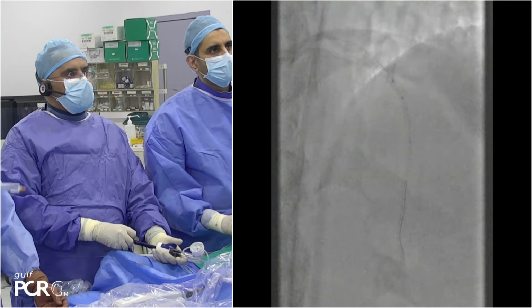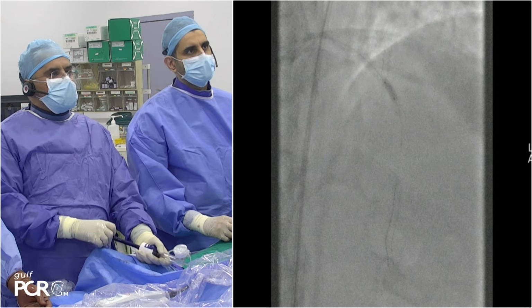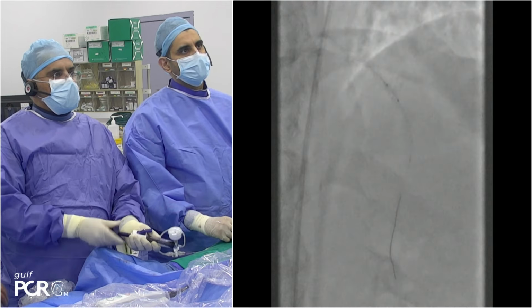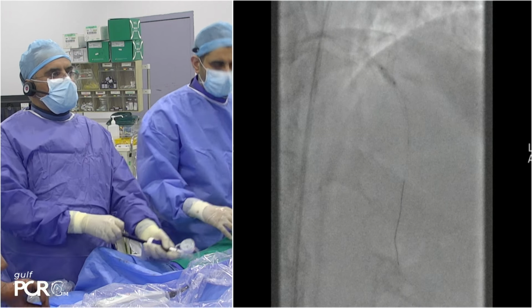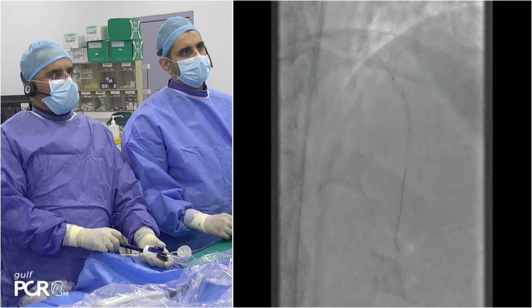Now, there is a thrombus. We should sort it out, but I think under expansion is an issue rather than malposition. So I don't think you should be really worried about the proximal mild malposition when it comes to thrombosis, but it's the under expansion. So I think you need better expansion in the distal to reduce the chance of thrombosis.